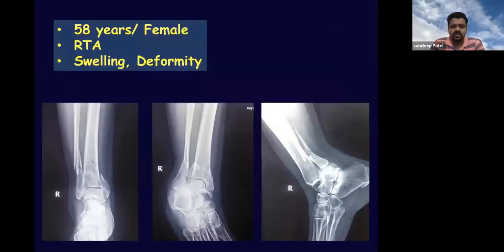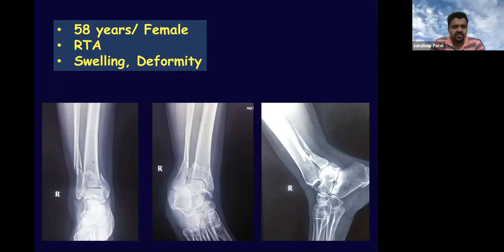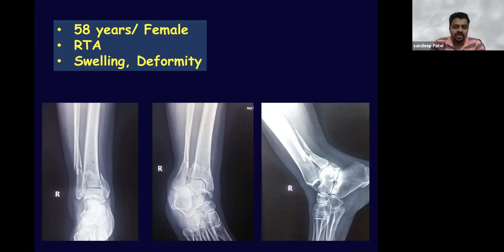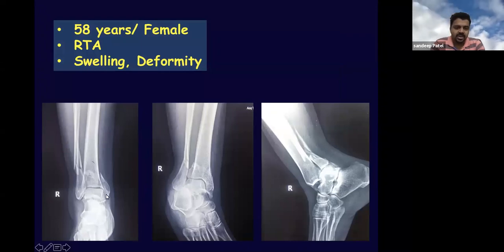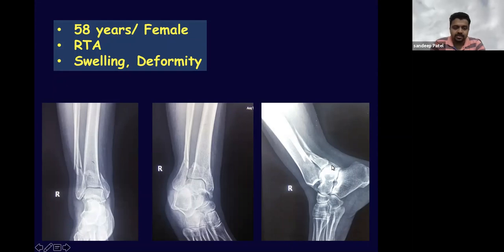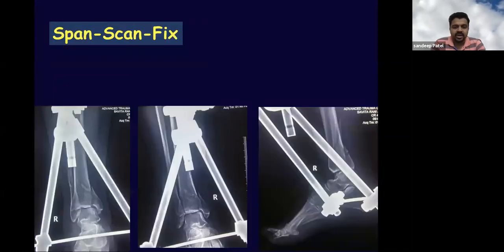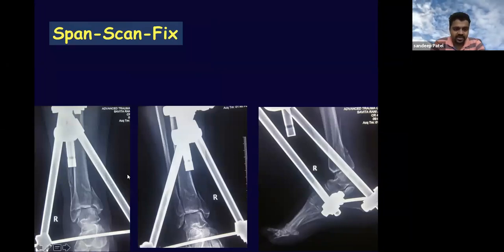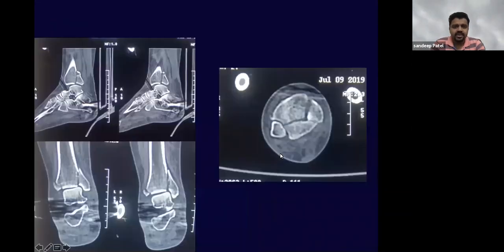This refers to a case: a 58-year-old female who sustained a road traffic accident with swelling and deformity. Examination reveals a trimalleolar fracture — a medial malleolus fracture, a fibula fracture running all the way up, and a posterior malleolus visible in the lateral view. It is a PER4 injury — pronation external rotation. We follow the span-and-scan principle: we span the fracture first, then proceed to CT scan for a better appreciation of the morphology.